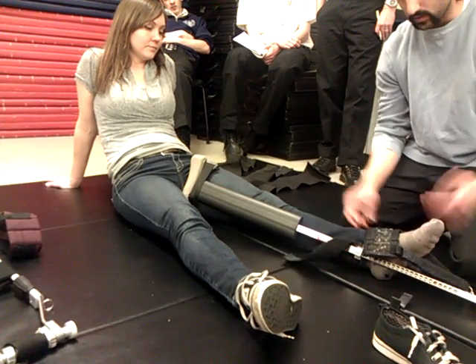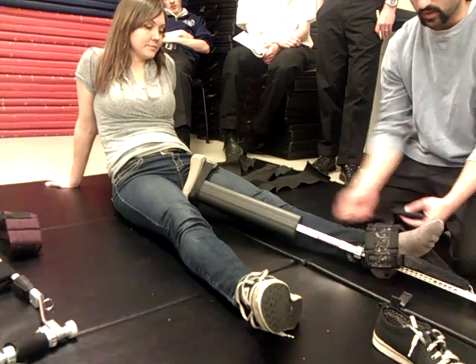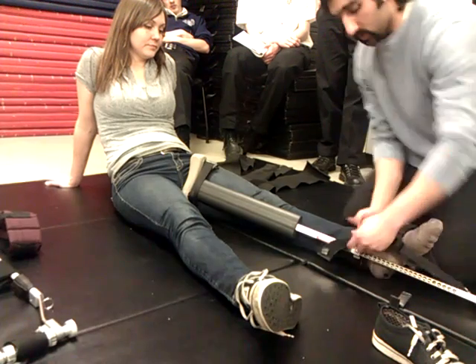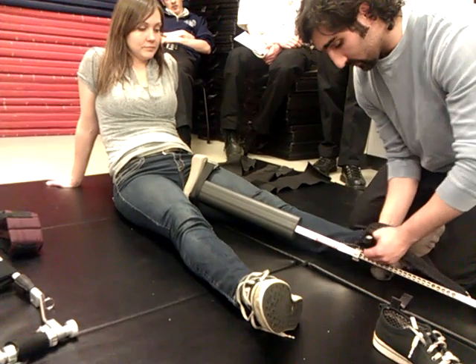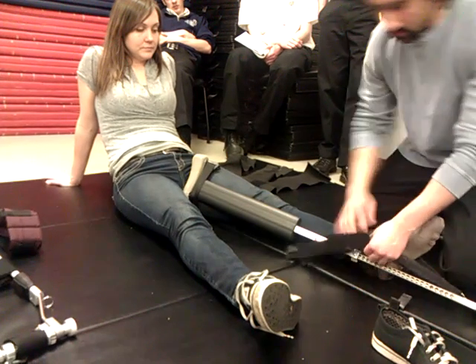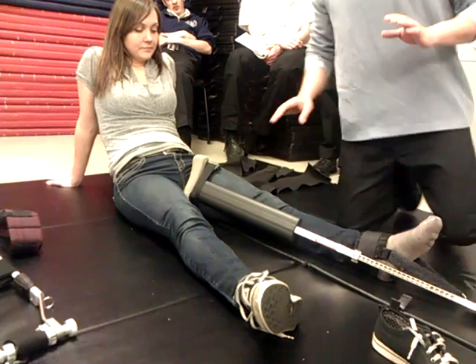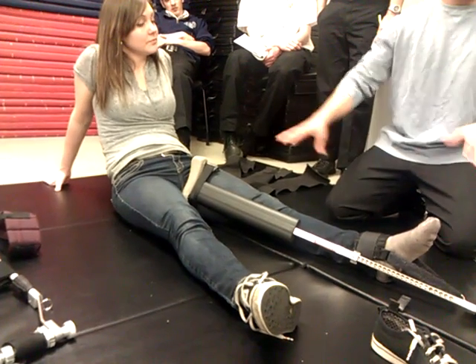If they have a thicker leg, you're going to have these cushions to accommodate for it. If they have a thinner leg, you can just pull it out to make it a little bit tighter. Right? So from there, we're going to go ahead and secure this as best as possible while trying to maintain the leg and have minimum movements. You're going to secure that as tight as possible. So that's pretty much it as far as getting this device secured and ready to go.